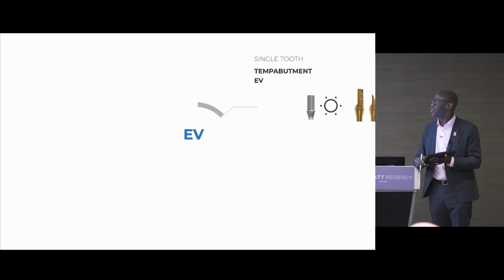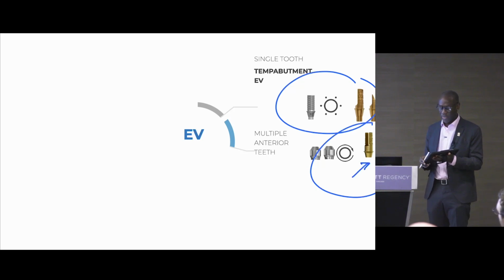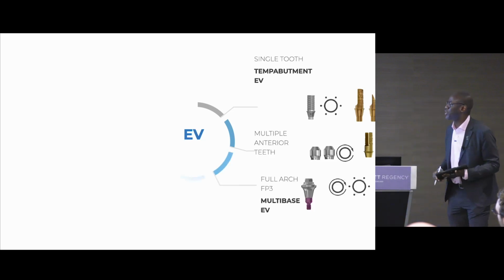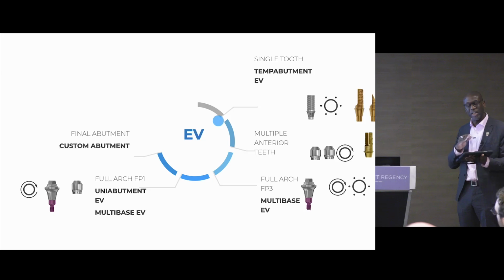So the other thing to talk about is, where does this fit in to this particular workflow I'm talking about? It fits in because we can use the hybrid base G here when we're dealing with single teeth. We can use it for multiple teeth. If we go to the fixture head, we can use it there. So again, a small 2-unit bridge can be used for that. We can also use it for full arches, and again, these are the 2 different platforms with this implant system.